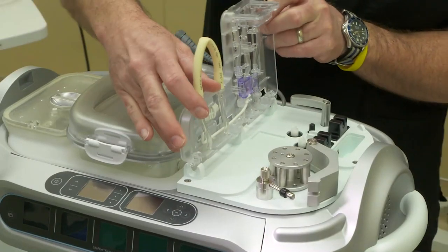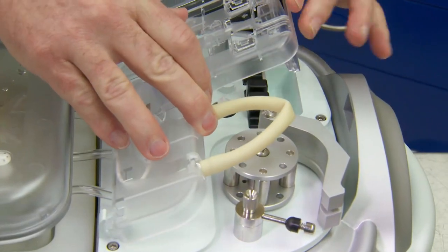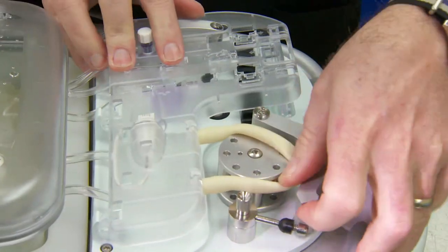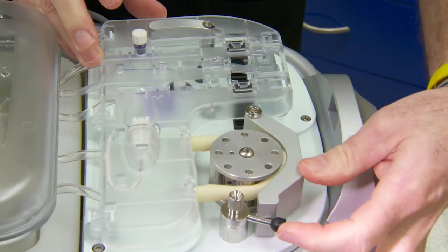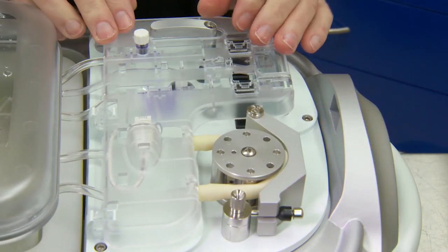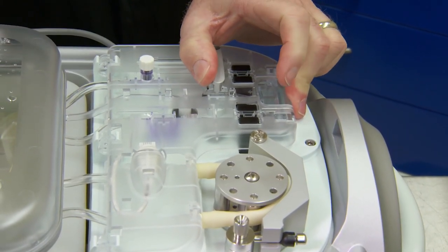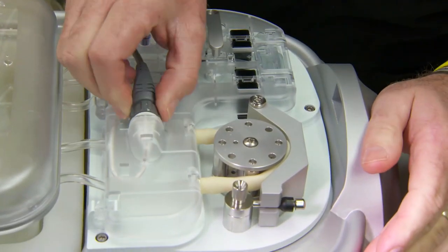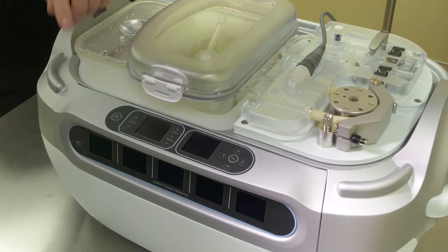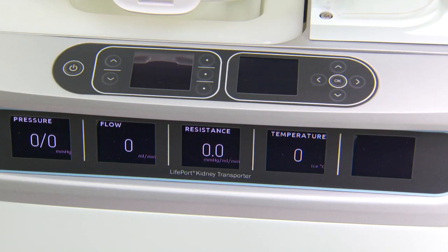At a 90 degree angle, insert the tube frame into the U-clamps. The beige tubing is then placed over the pump head. The raceway is closed and the spring latch arm is locked. Apply slight pressure between the bubble detectors and close the locking arm. The pressure sensor cable is then installed. At this time, the unit can be powered on and it will go through a series of self-checks.